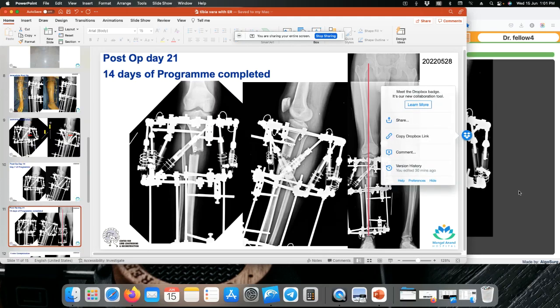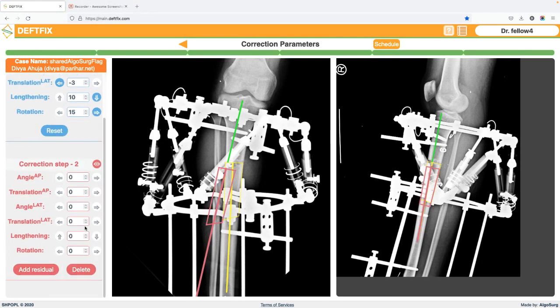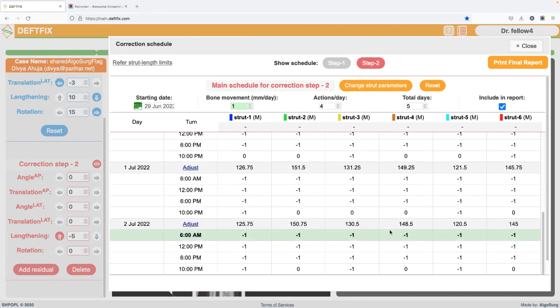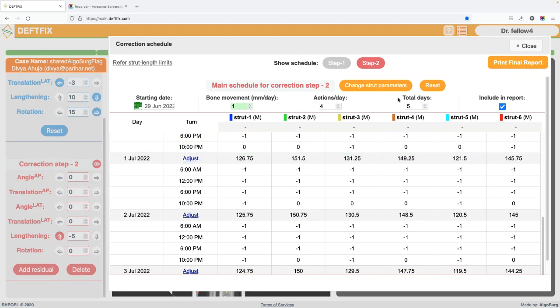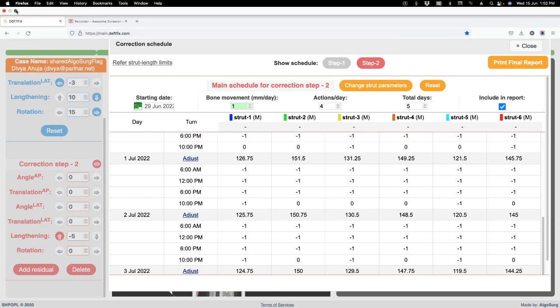We go back to the program and use the add residual function. Everything else being good, we add 5mm of compression. The red contour has moved closer. We print the updated schedule — that is the amount of compression required. This can be done gradually over five days, but since it is just compression we have done it over a couple of hours in the outpatient setting itself, finishing all the compression acutely.